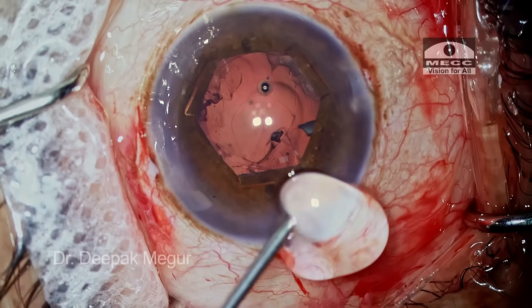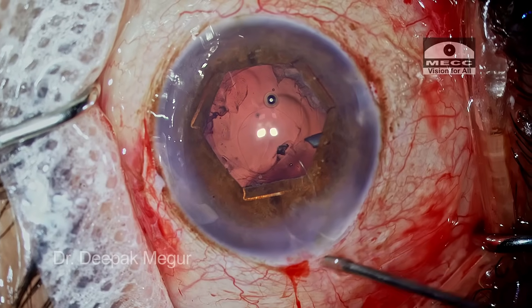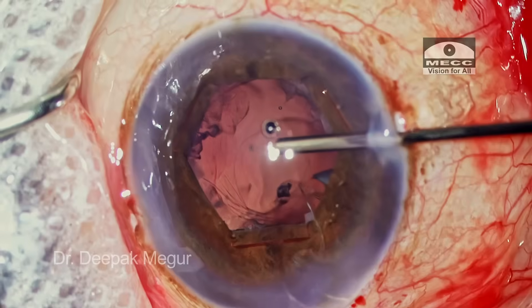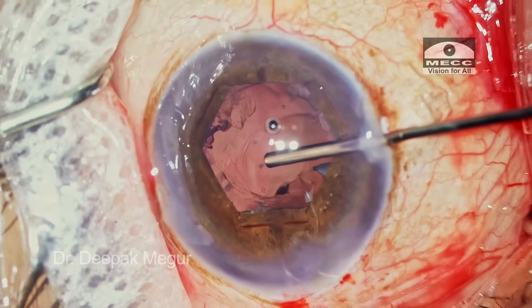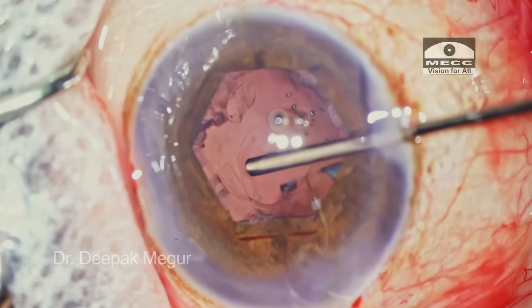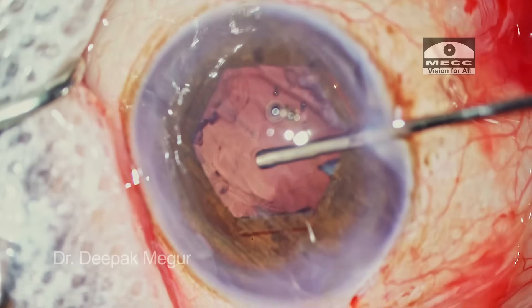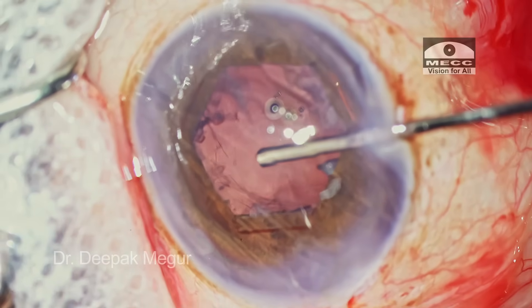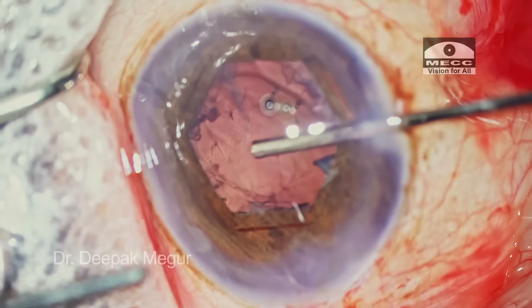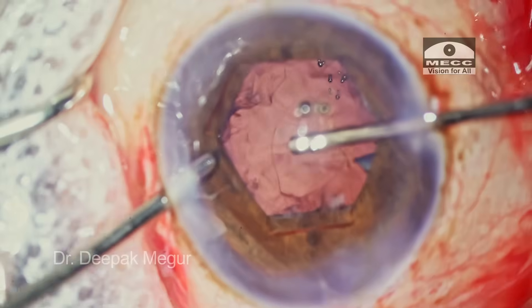You can always test the cutter outside the eye by placing a little bit of OVD on the wound. Once you are certain the cutter is working, introduce it into the eye. Because the chamber is already filled with OVD, I am not introducing my irrigation just yet. The cutter goes in with its bevel facing posteriorly, positioned below the posterior capsule tear. Slowly and surely, I begin cutting and the prolapsed vitreous fibres are being pulled back towards the cutter behind the posterior capsule. As corneal folds appear suggesting the eye is becoming softer, I introduce the irrigation cannula, keeping the bottle height as low as possible — around 30 to 35 centimetres — just enough to maintain irrigation.